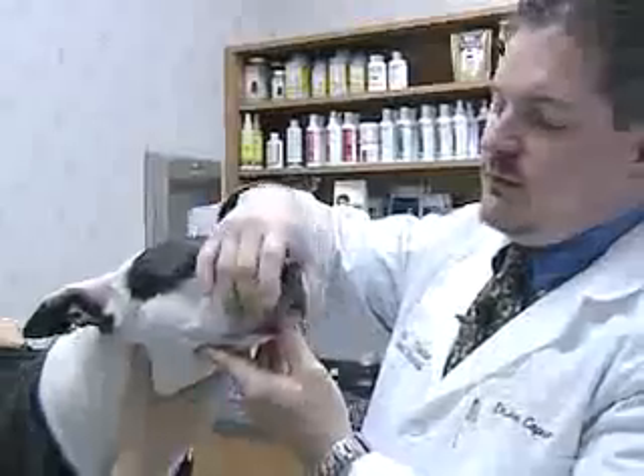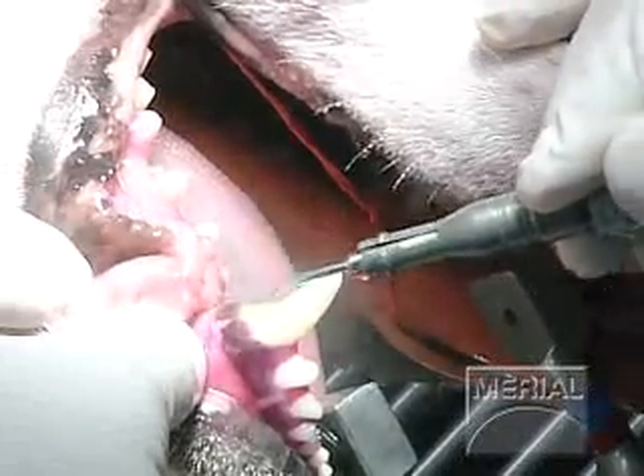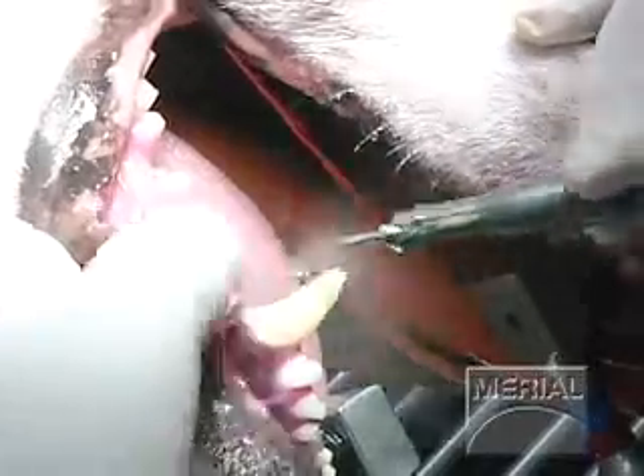Some of these steps will be done while the pet's awake, which is doing a thorough oral examination. We'll also be doing a very thorough examination under general anesthesia. And then we'll be cleaning the teeth, which includes cleaning the crown and sub-gingivally.